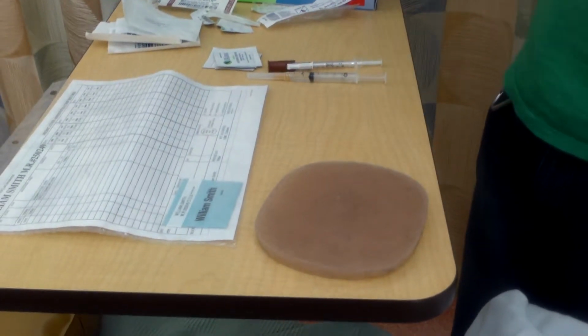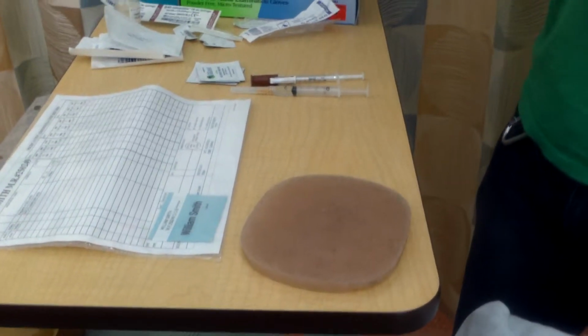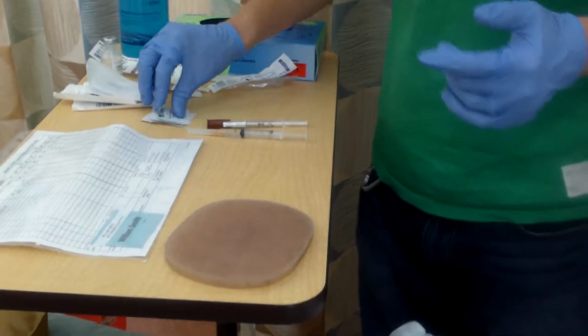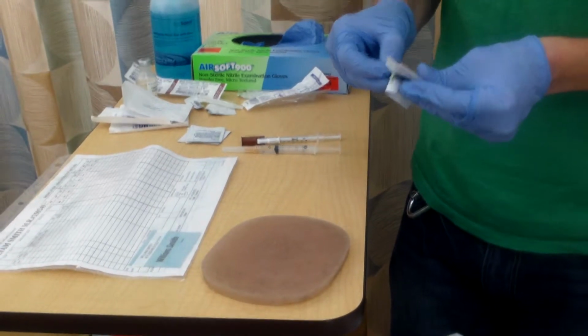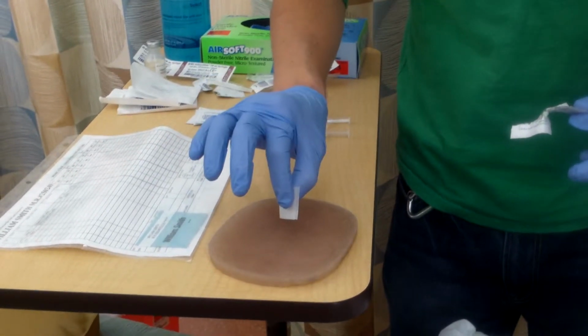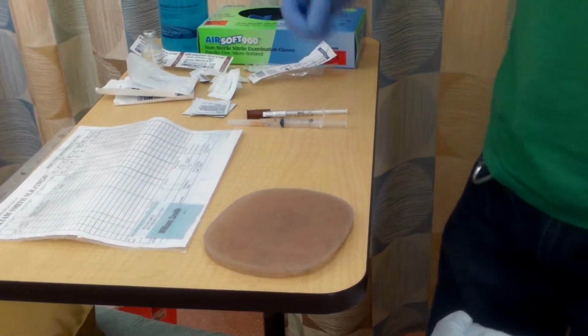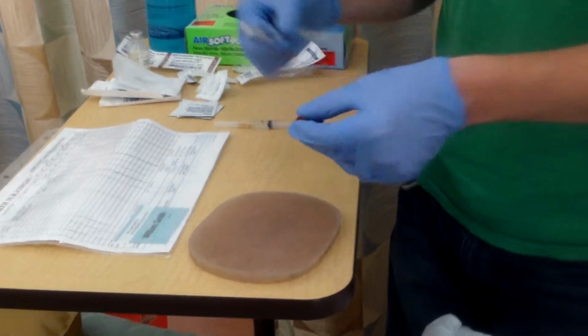I'm going to put on some gloves. After I've found the appropriate site, I need to clean the site. So I will use my alcohol wipe. I would start with the center and work my way outward in a circle. So once I did that, and I have the right site, we'll then administer the drug.